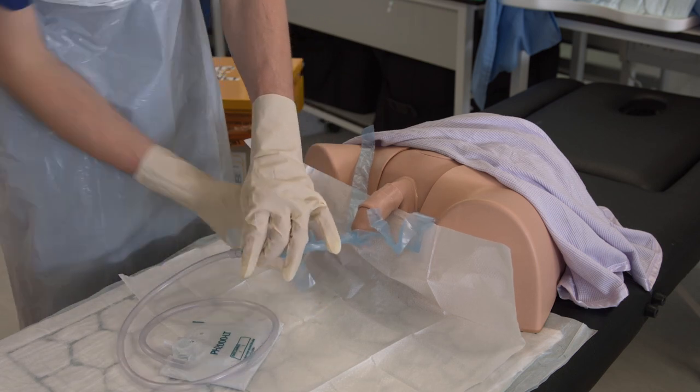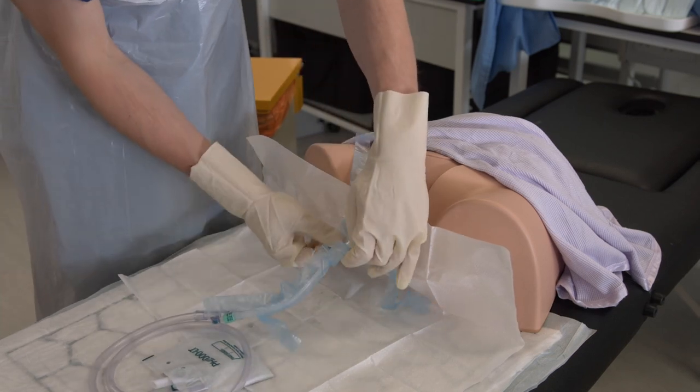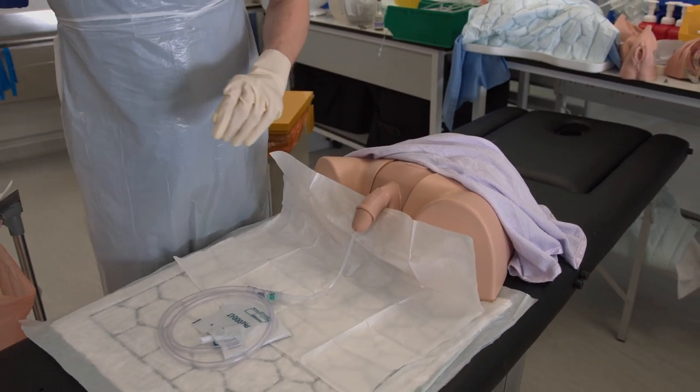Once the balloon is inflated, pull back gently on the catheter until there is slight resistance to site it at the base of the bladder. Then remove the remaining perforated packaging.